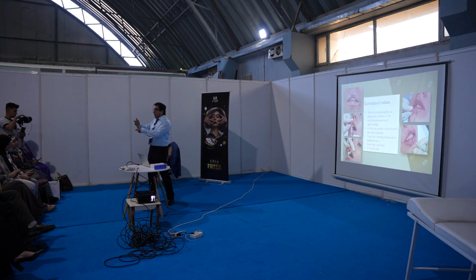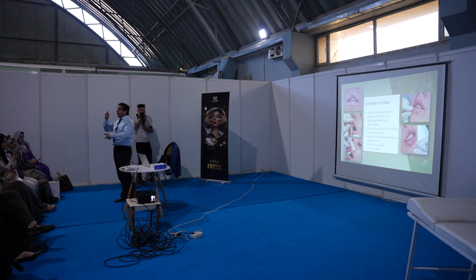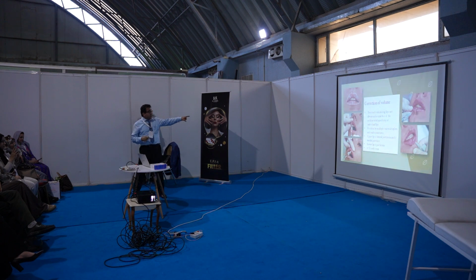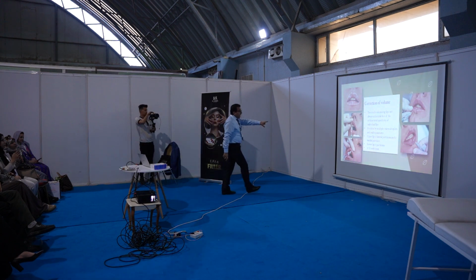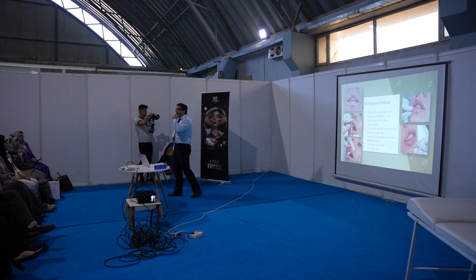You know that we have the linear injection and the microbolus injection. So within the body of the lips, at the center of the vermilion.